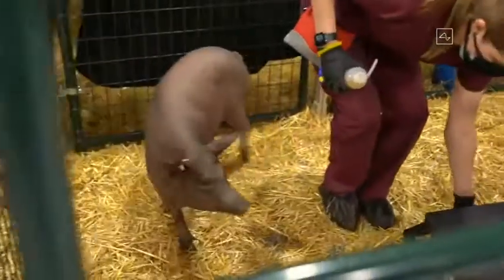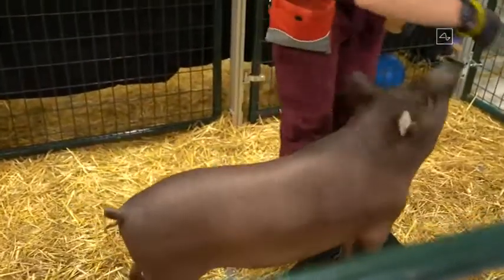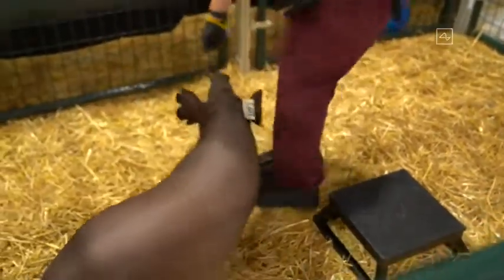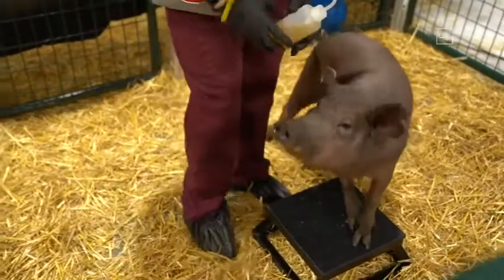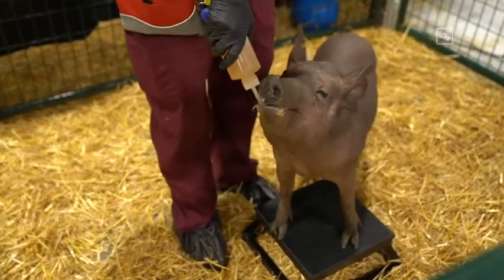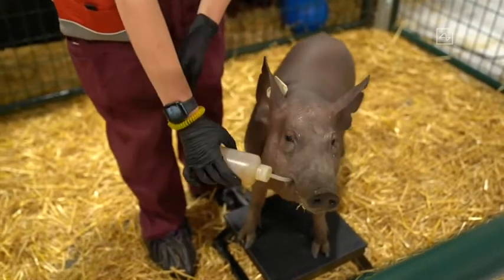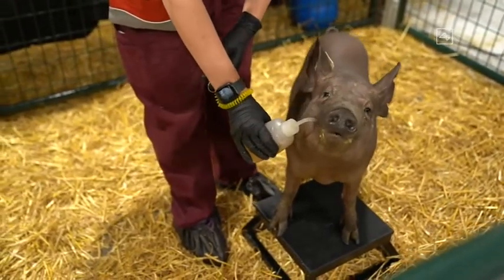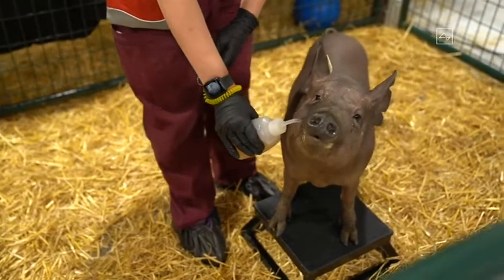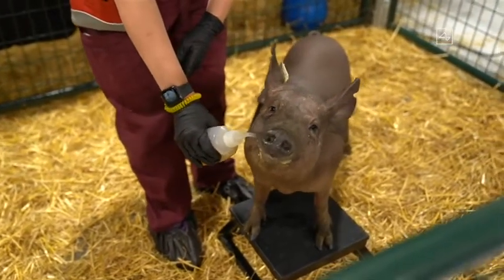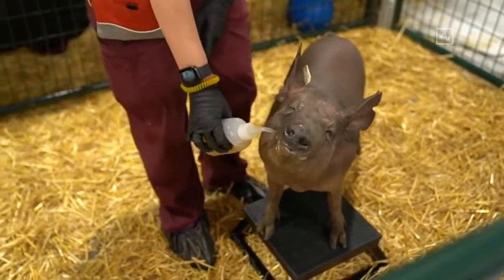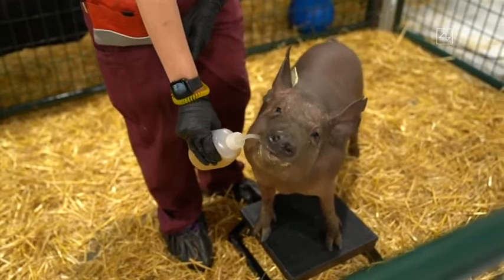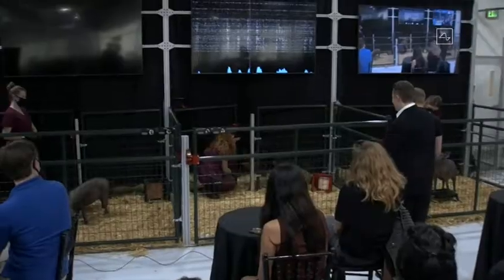Oh my god, there's Dorothy. In the case of Dorothy, she used to have an implant and then we removed it. So this is a very important thing to demonstrate: reversibility. If you have a Neuralink and then you decide you don't want it, or you want to get an upgrade, and the Neuralink is removed - is it removed in such a way that you are still healthy and happy afterwards? What Dorothy illustrates is that you can put in the Neuralink, remove it, and be healthy, happy, and indistinguishable from a normal pig.